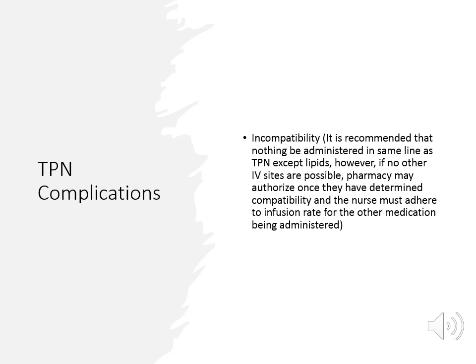More TPN complications continued includes incompatibility. It is recommended that nothing is administered in the same line as TPN, and that line is normally identified for everybody accessing the central line, so that they know that that's the port that the TPN goes through. Most things are not compatible in solution with TPN. There may be special circumstances, and it should be documented that it was checked with pharmacy that you were able to give something with the TPN through the same line.